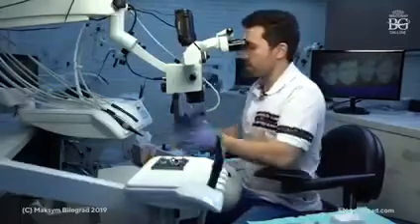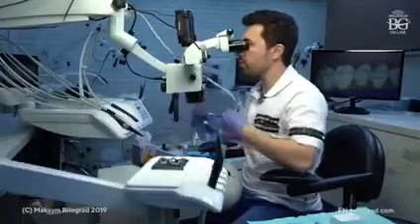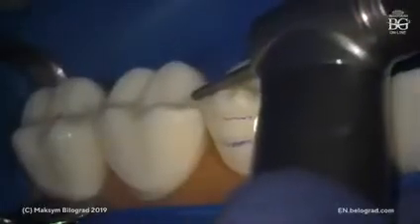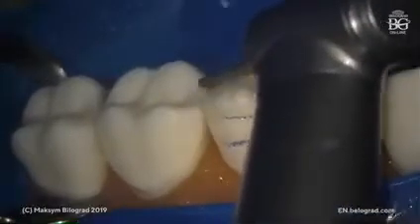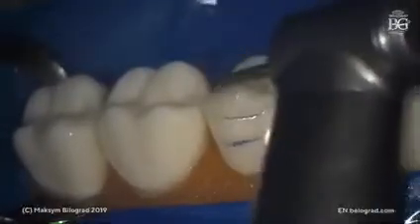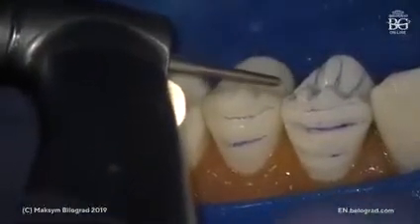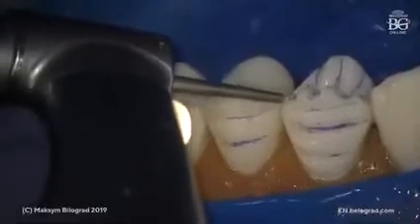So now we go for a partial reduction. This is a premolar, and now we have to cut inside, not the incisal, sorry, the tip part. See how I do this? I angulate my burr the same as the distal angulation of the cusp. Then I turn my burr towards the mesial aspect of the tip of the cusp, and I go from the occlusal surface towards buccal.